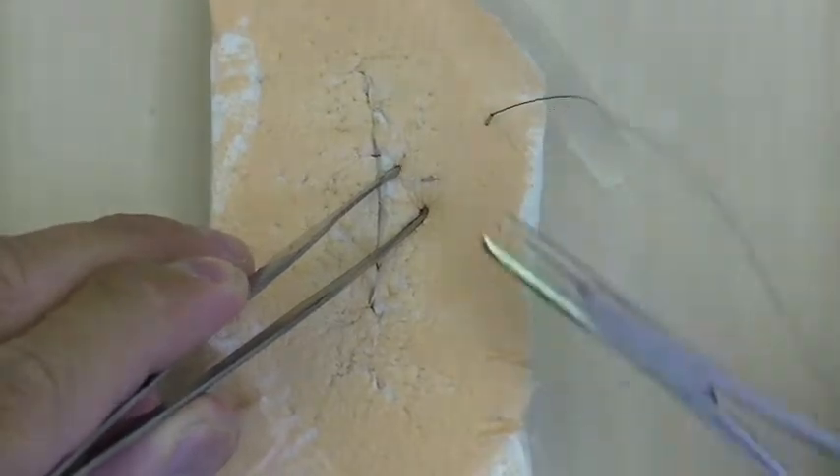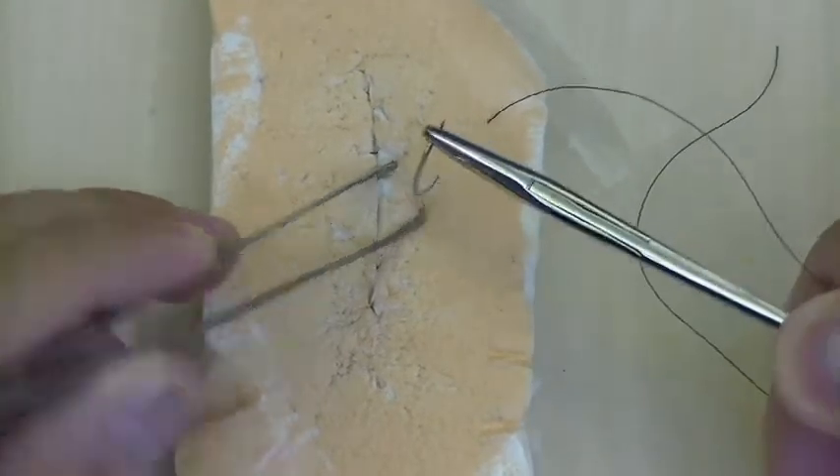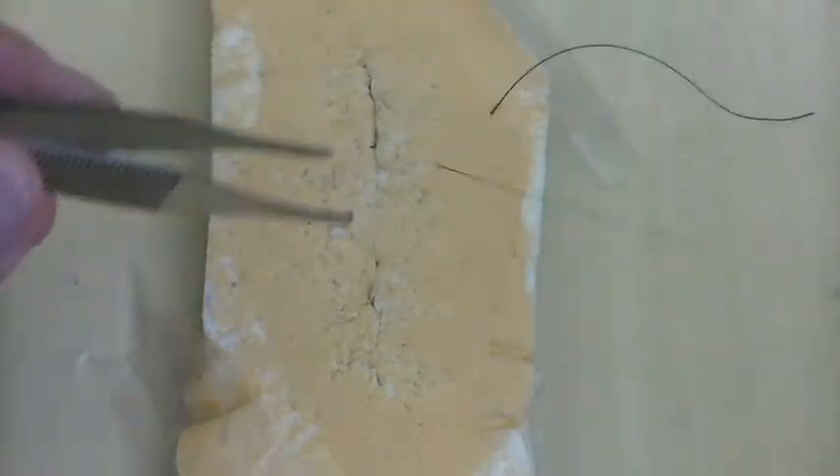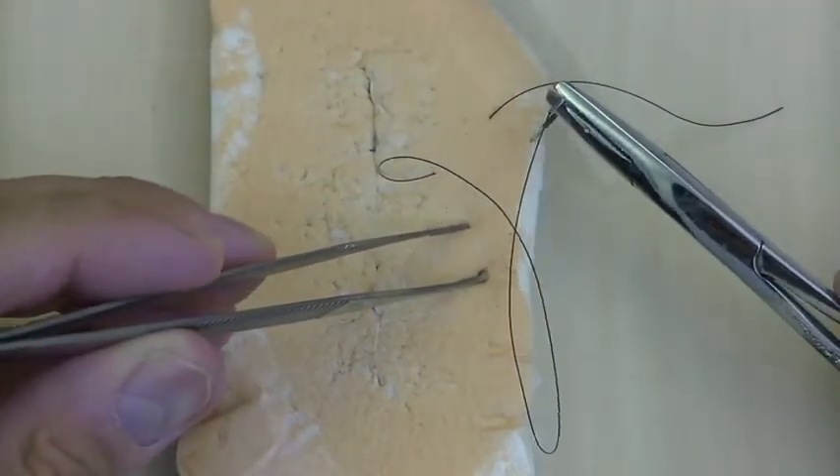This is actually kind of like a horizontal mattress suture, but you're not going to reverse the needle. You're going to grasp it again, pull the tail kind of short, and then take another bite here.